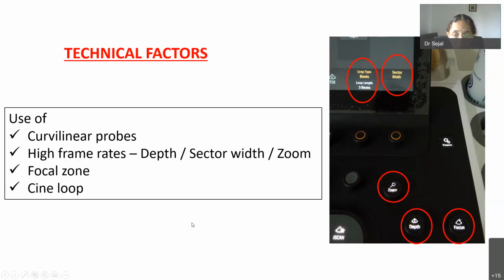Remember, for fetal echo, we do not need any extra precautions to be taken or preparations from the mother's side. It's important for the mother to come after having her breakfast or food, and not to come on an empty stomach. Specifically need to inform the mother that a full bladder is not necessary. It's important to counsel the mother that this test is a little long-lasting test.